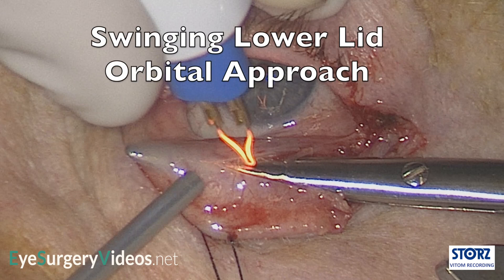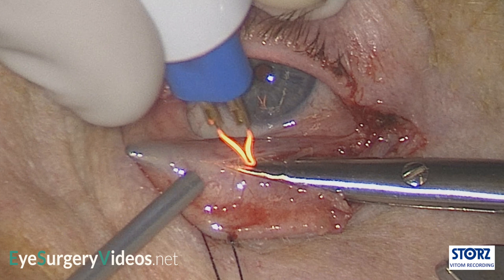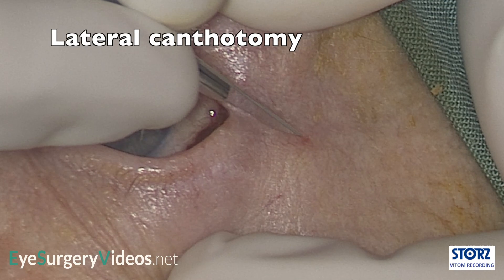The swinging lower eyelid approach is an inferior conjunctival approach to the orbit combined with lateral canthotomy and cantholysis. This allows the lower eyelid to be retracted away from the orbital rim, particularly laterally, as if it is being swung on a medial pivoting point. The swinging eyelid approach provides excellent access to the inferior and lateral orbit and orbital walls.